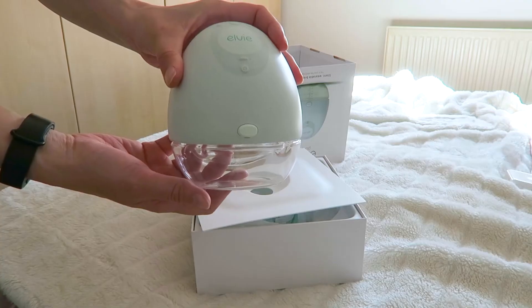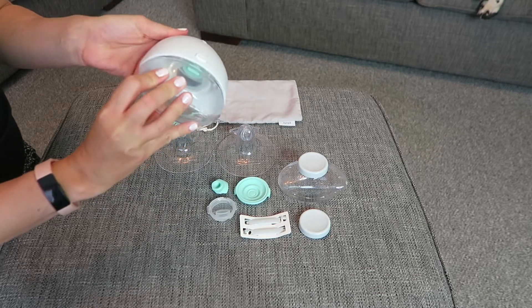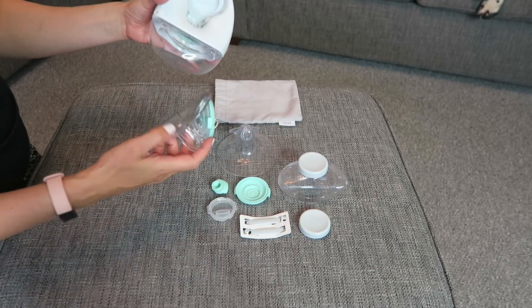This is the Elvie Breast Pump, which I've been using for about three months now, so I can give you a really honest review. There are some definite pros, but also there are some definite cons.